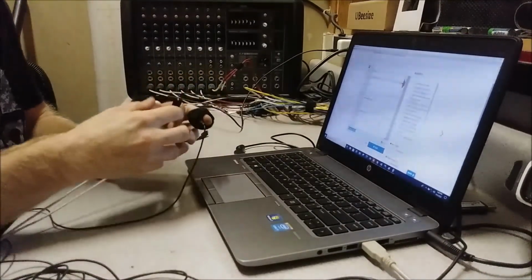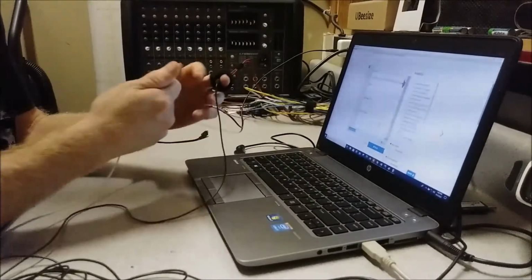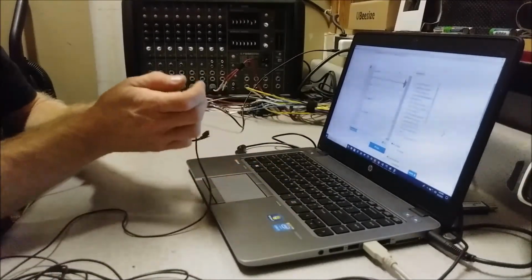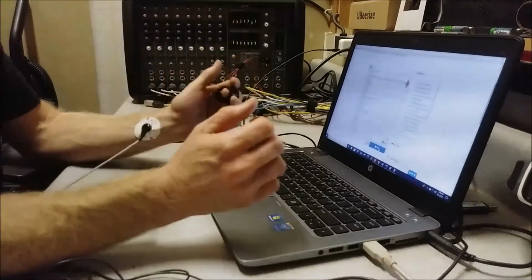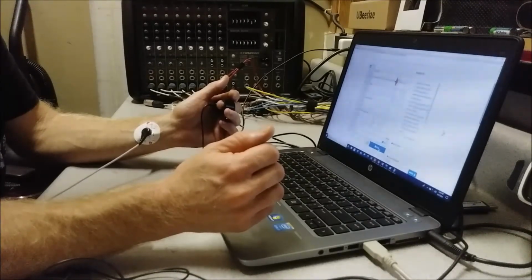So now that I've worked out for about 3 minutes straight, I'm going to attach the electrodes as well as the pulse meter, and we're going to start taking some measurements. And then I'm going to go through and measure average heart rate as well as the interval durations for each of the waves we measured during the resting phase.